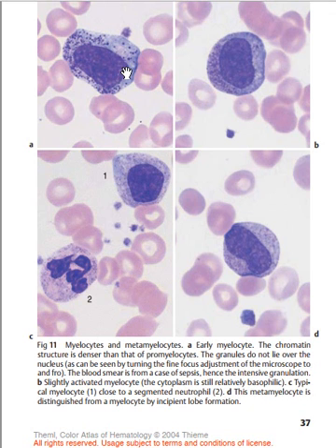Is it clear? That's why a promyelocyte is going to have, and this one here is a myelocyte. You already see that there's a dark bluish portion which corresponds to the heterochromatin or the condensed form. Is it clear?